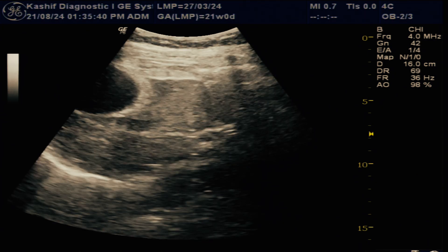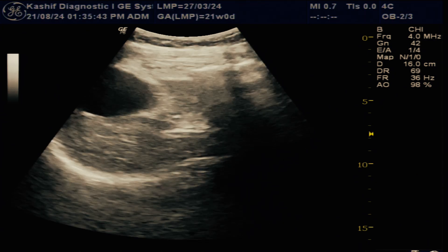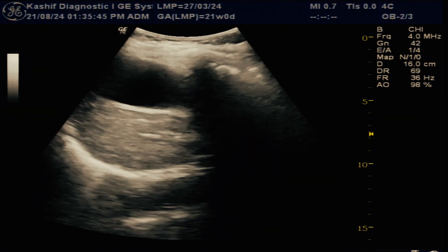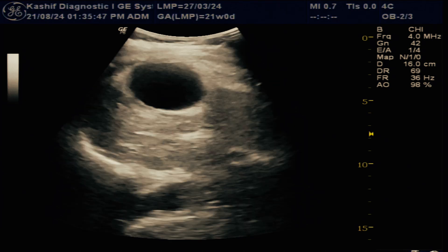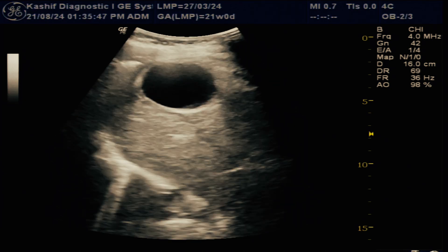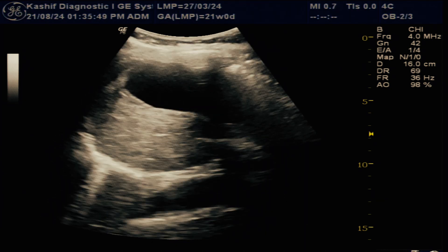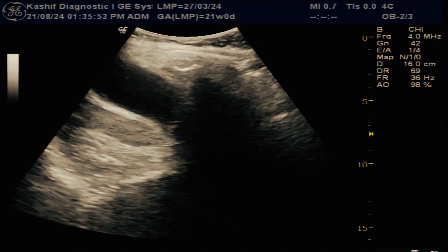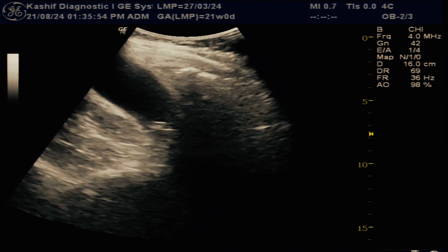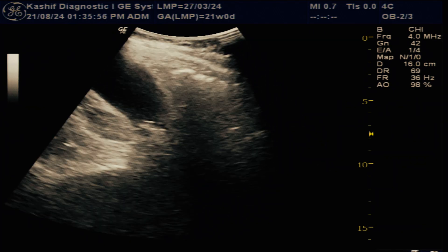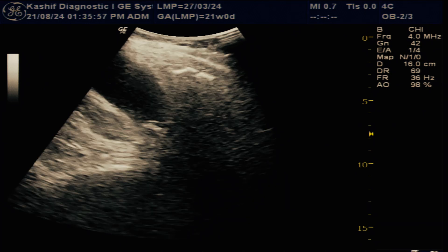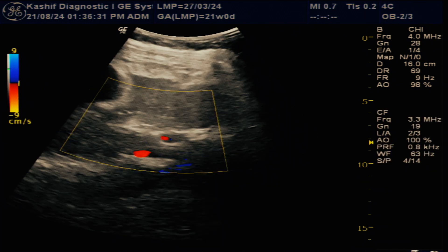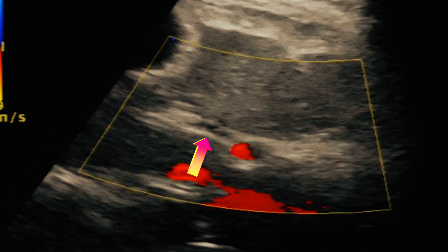When the hepatic cystic area is further evaluated, we see that it is elongated and thin-walled, filled with clear fluid. We see small echogenic areas that are calculi in the gallbladder. The CBD is also visualized and measures less than 3 millimeters, which is normal and not dilated.